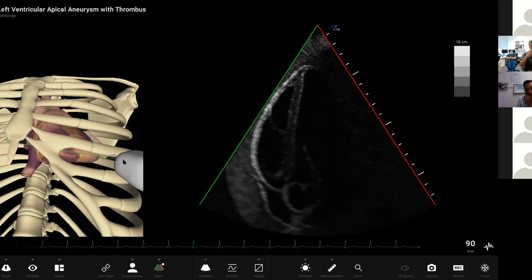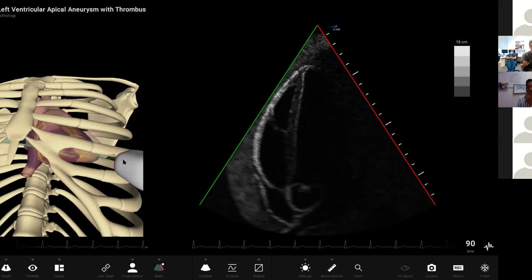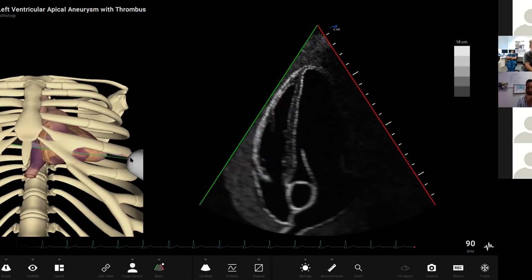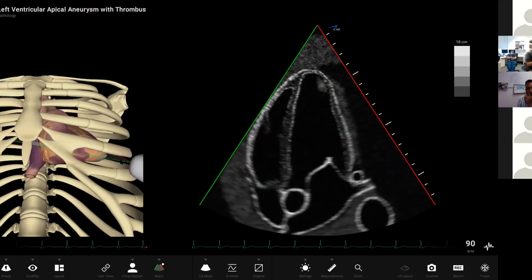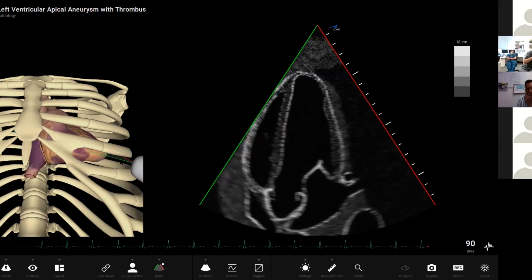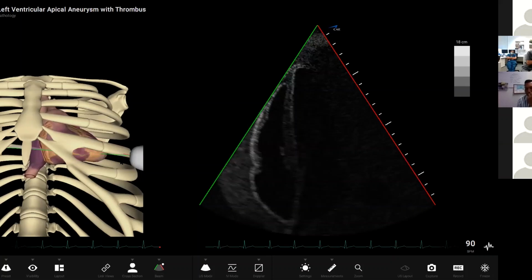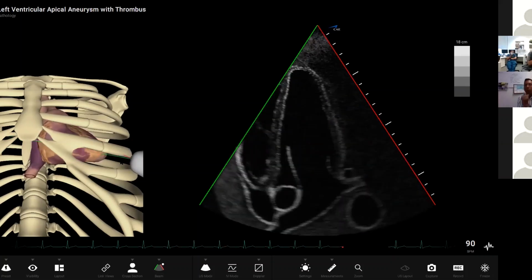And this is one of the other common maneuvers that I describe, which is never going to make it into a textbook because I call it snuggling. Snuggling is where you almost use the skin turgor to pull the echo probe down into that intercostal space, and I try to snuggle into that intercostal space. It's almost like rolling off that upper rib, coming down into that rib space. I'm not pressing in harder, I'm pulling down harder and snuggling into that intercostal space.